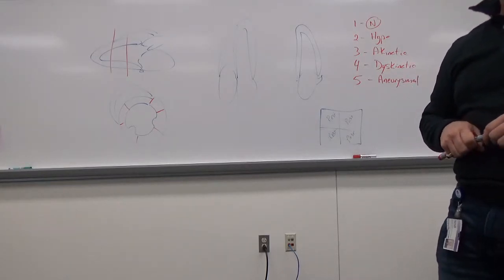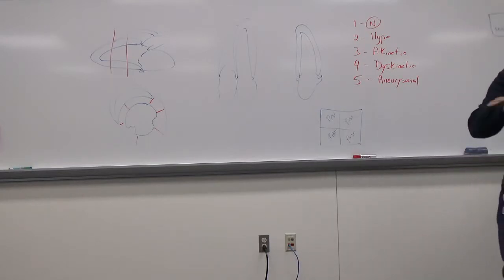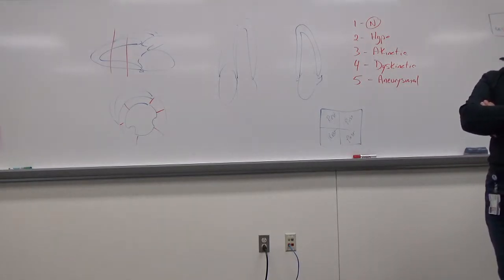Question about dobutamine in a pacemaker. Yes. Understanding that everyone wants the best for the patient, when we have the patient, even if the patient came with a nurse from, say, the ER or wherever, is it our responsibility as technologists to look at the chart and know that they have a pacemaker before dobutamine is administered?